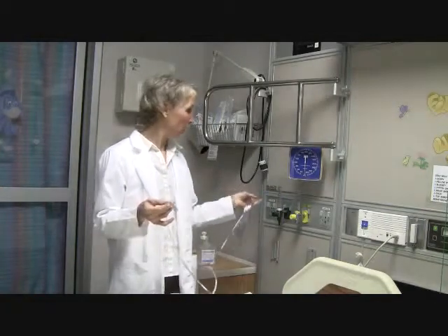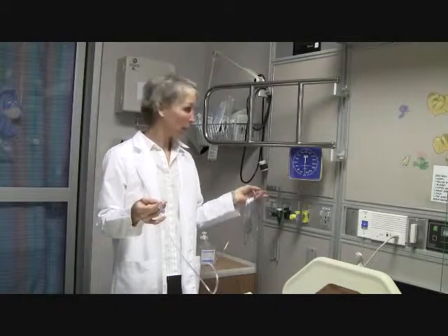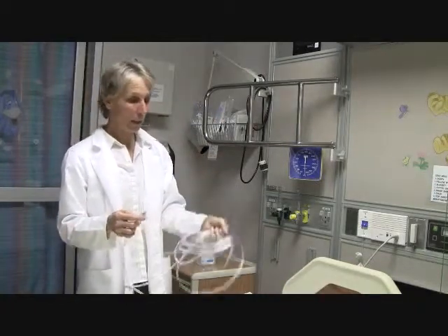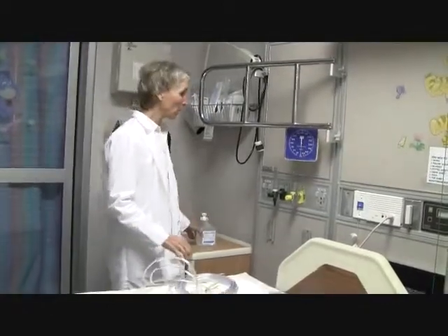Now, if you set your nasal cannula flow rate to 4 liters or above, you must add a humidifier to the oxygen. However, you can add humidity at lower flow rates per patient comfort. For example, if the patient has complaints of dryness or nosebleeds, you can go ahead and set a humidifier to your oxygen.